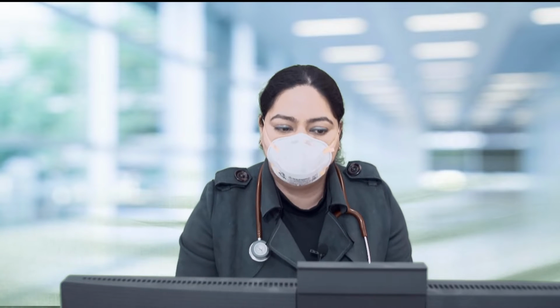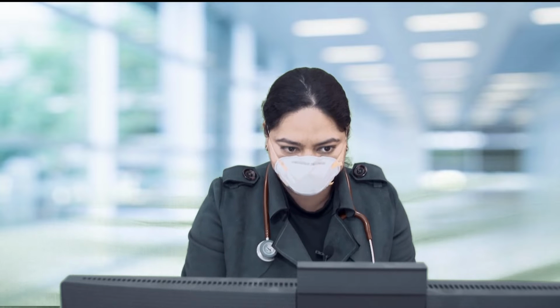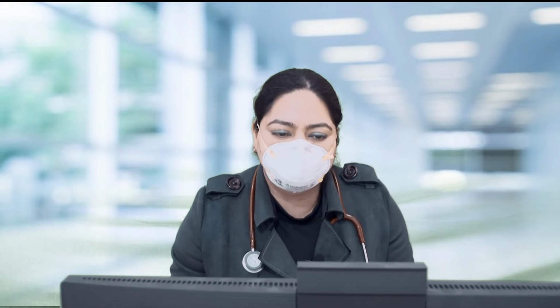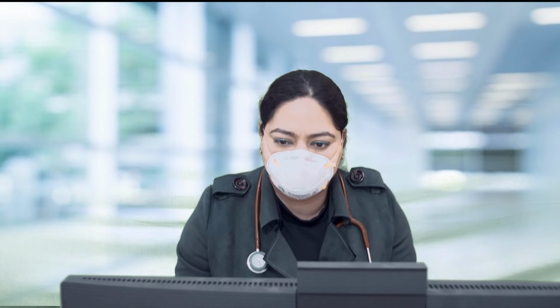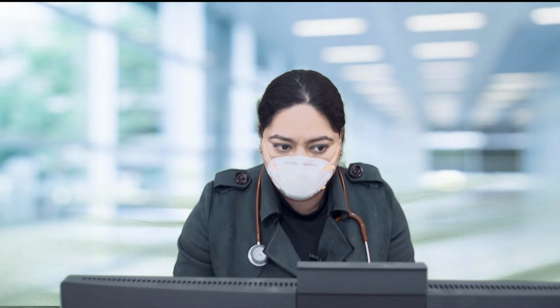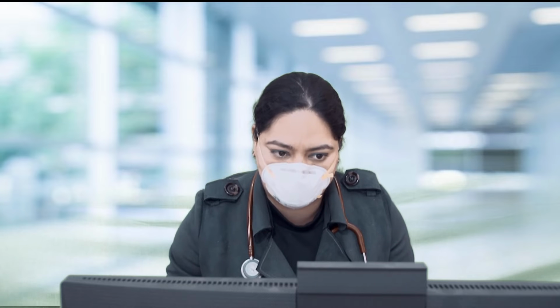However, the clear-cut indication of NIV in hypoxic respiratory failure, where only the oxygen is low and carbon dioxide is normal, is not very established. But we've been using BIPAP in our COVID-19 patients. So why are we using NIV? Because there was a study on de novo acute respiratory failure, as a preventive strategy for avoiding intubation, where BIPAP therapy was used.